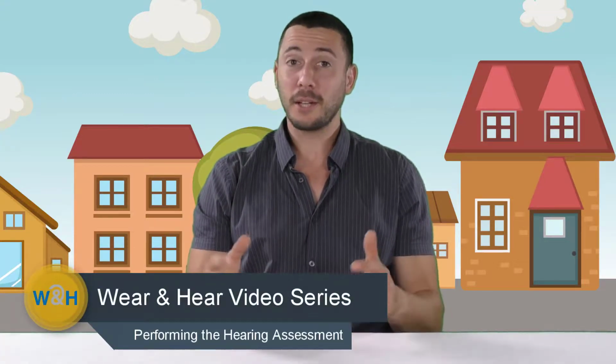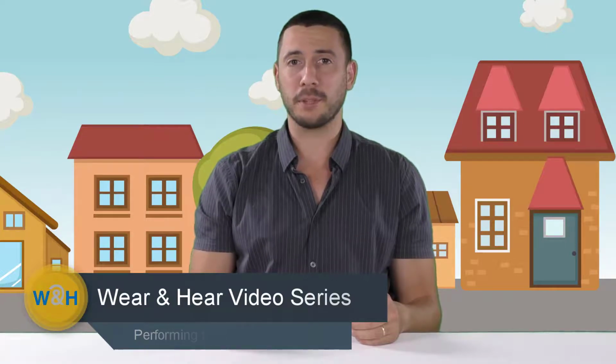Your BeHear headset is ready to use out of the box. It comes pre-programmed with 4 different hearing presets or profiles: indoor, outdoor, crowd, and live music. BeHear now lets you customize its hearing enhancement properties using a built-in hearing assessment. After you perform the assessment, the results are automatically applied to the existing hearing profiles to suit your own preferences.